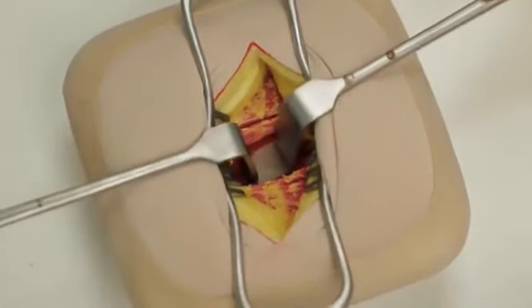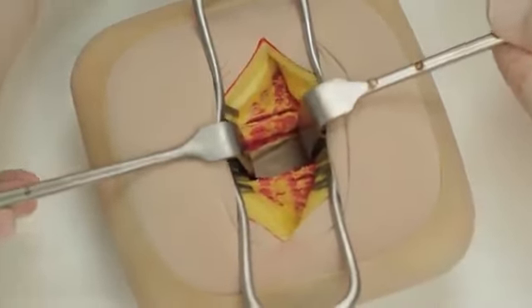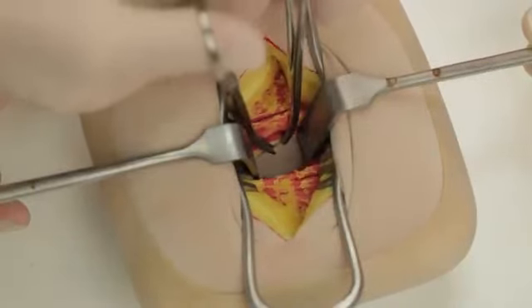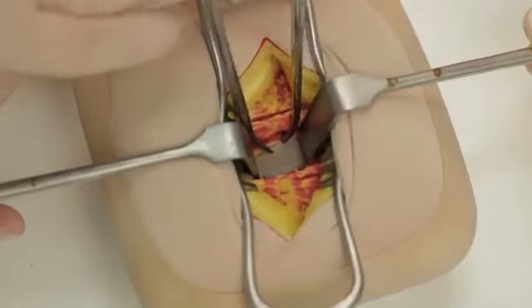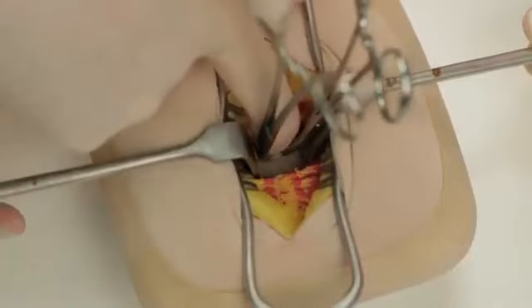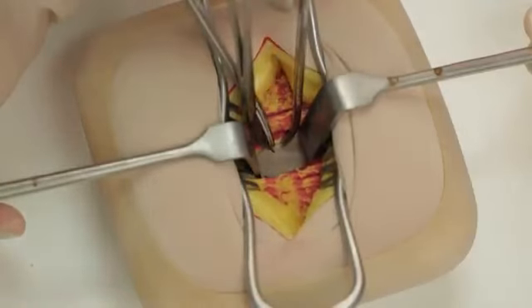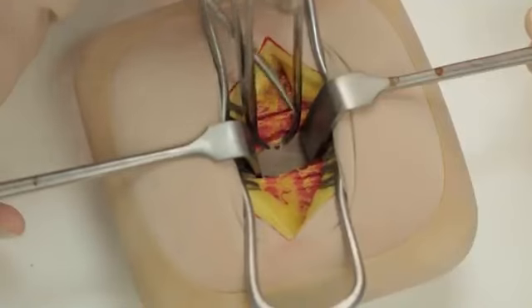Beneath this muscle, the fused transversalis fascia and peritoneum will be visible. Apply 2 mosquito forceps to a fold of peritoneum and ensure that only peritoneum is held by pinching the peritoneum between your fingers. Make a small incision in the peritoneum using either dissecting scissors or a knife and enlarge the hole in the line of the skin incision.